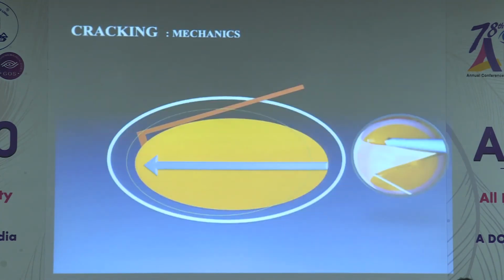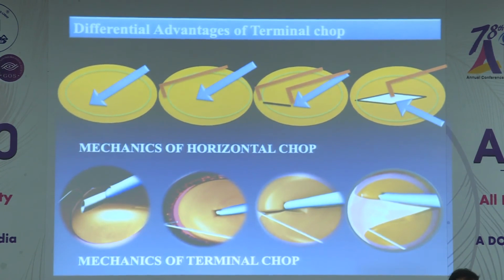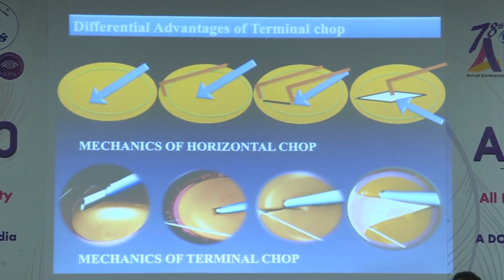I just want to show you this very important slide, since people keep on asking how this technique is different from the horizontal chop. People say it's kind of a horizontal chop. No, it's not at all. It's absolutely different. You can see here in horizontal chop, your phaco probe is directed towards the center and deeper into the nucleus. But in terminator chop, your phaco probe is directed superficially towards the equator. That is the number one difference.